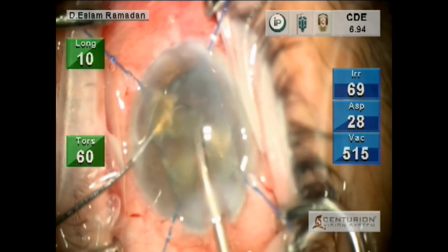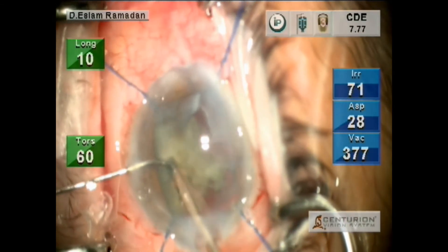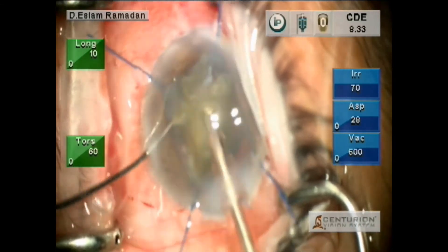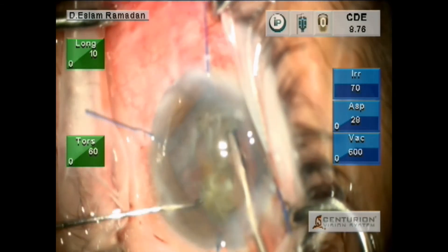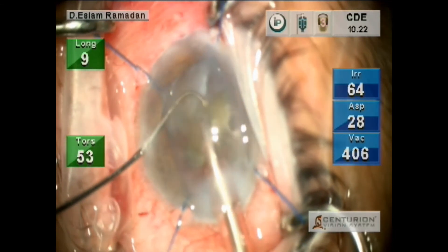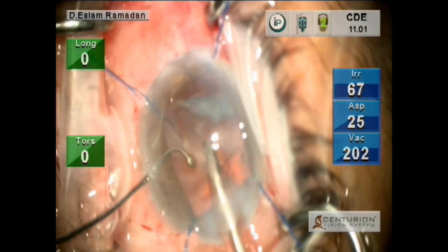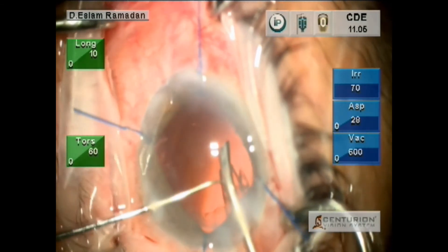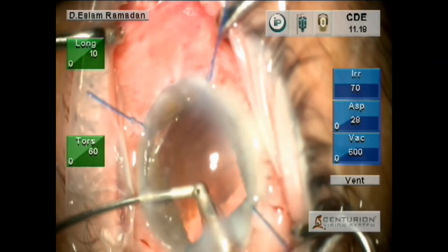In both machines we are using gravity, not active fluidics, in both machines, to make it comparable to each other. You can see the anterior chamber is stable — more stable than with the Infinity. Then managing the last piece, protecting the posterior capsule with the second instrument. For nucleus and cortical removal you can use the same setting, and then cleaning the cortex with manual irrigation aspiration.